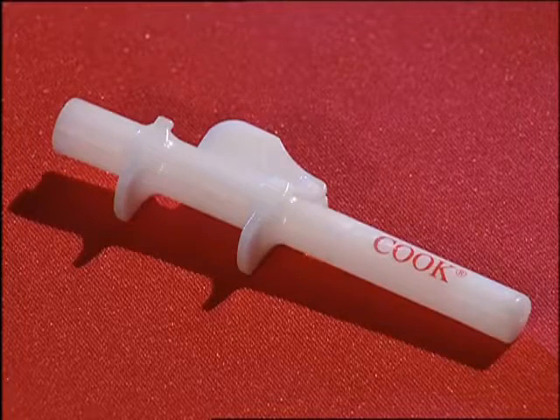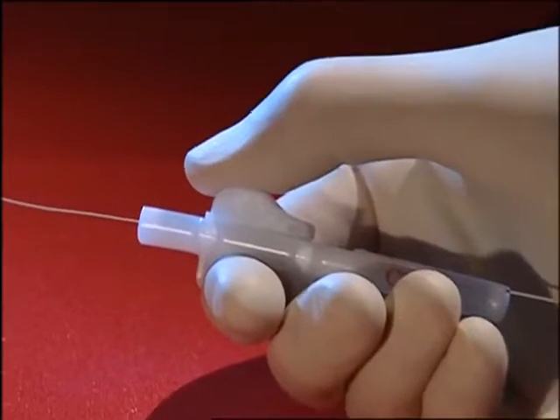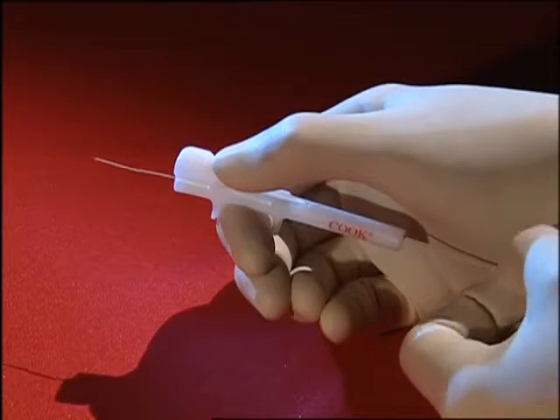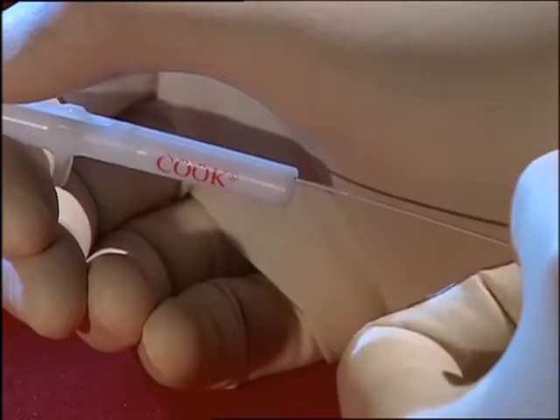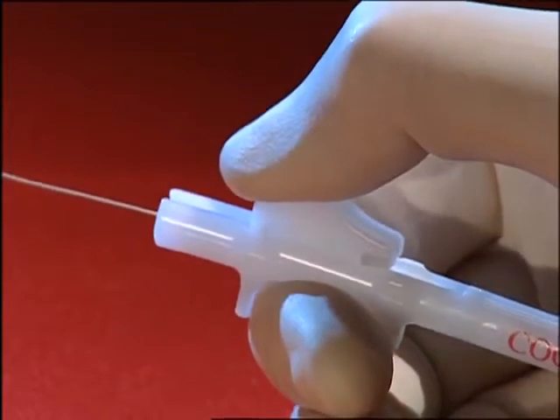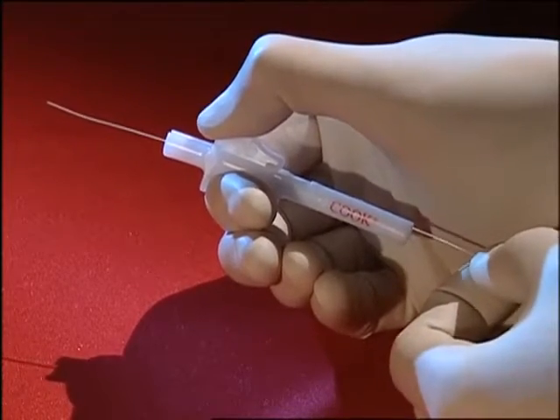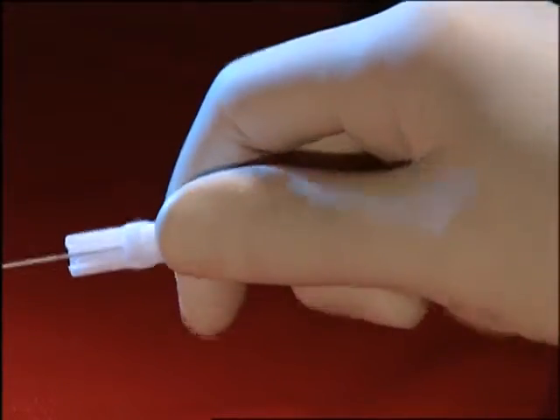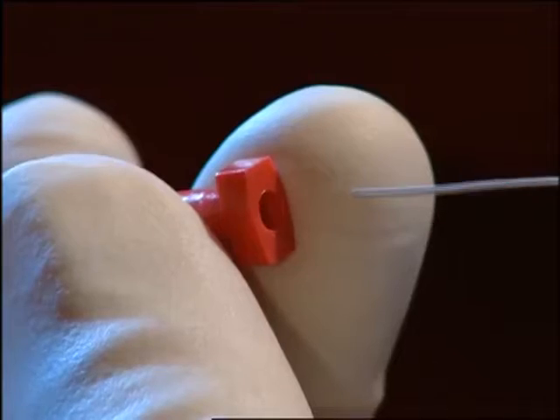A special handle device is provided to fix the wire and to make it easier to manoeuvre in the ureter. The introducer facilitates introduction of the wire into the ureteral catheter.